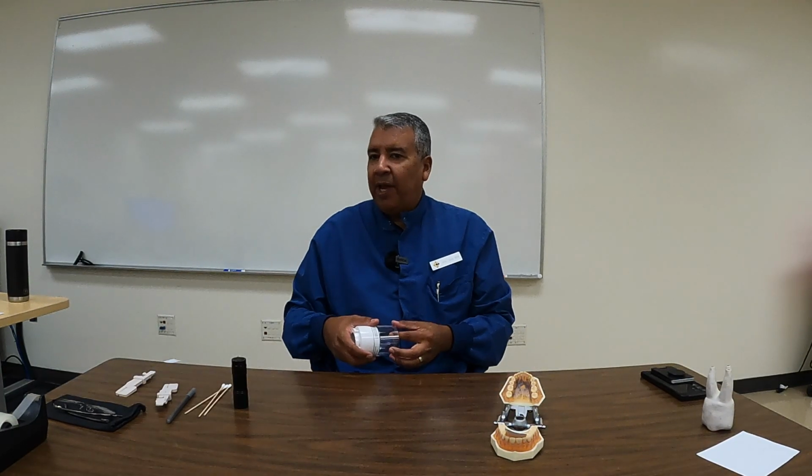And actually I love this question because wouldn't you agree that all of our mouths are shaped a little bit differently? So for some of your patients, it depends on how you have this patient sitting in the chair. And remember, I like that patient sitting nice and straight, that occlusal plane parallel to the floor. This is how you're learning. So remember, if you have your patient sitting in the chair and they're kind of slouched and sitting like this, it's going to really stress your angles out. You're going to really have a difficult time. Once you get this whole concept down, I feel like you can almost have this patient standing on their head and you'd still be able to take their x-ray because you know where the bisector is.